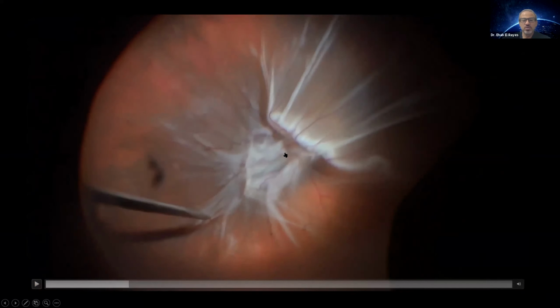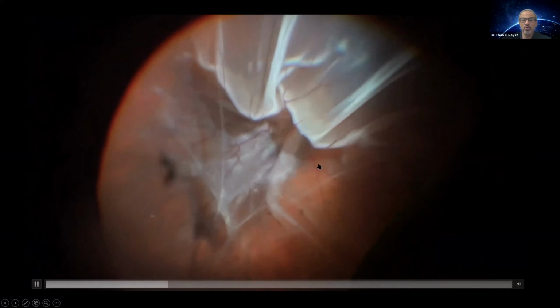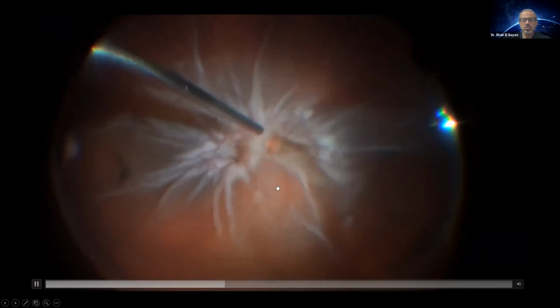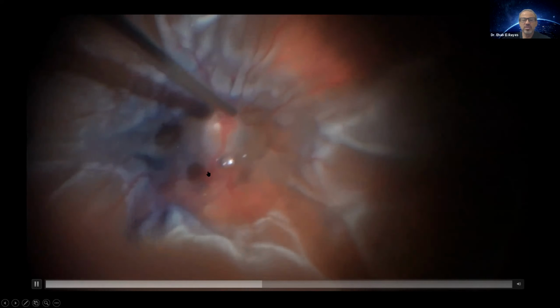Summarizing what we said, we start with the PVD. When you grab the hyaloid, you can grab it from different directions, looking at where the traction is happening. You don't want to be pulling here and get iatrogenic retinal breaks. So it has to be careful from one side, then you might grasp it from a couple of points to try to avoid creating breaks. Then you look at the other end here till it pops off, then you start using your cutter, identifying the membranes. Once you open the retinal surface, you know that there is stiffness.